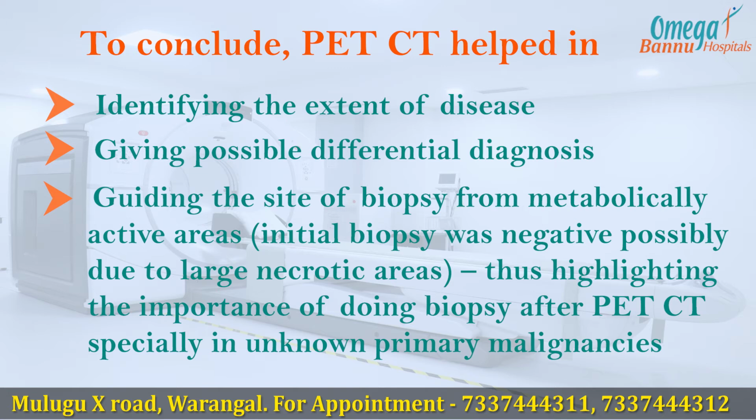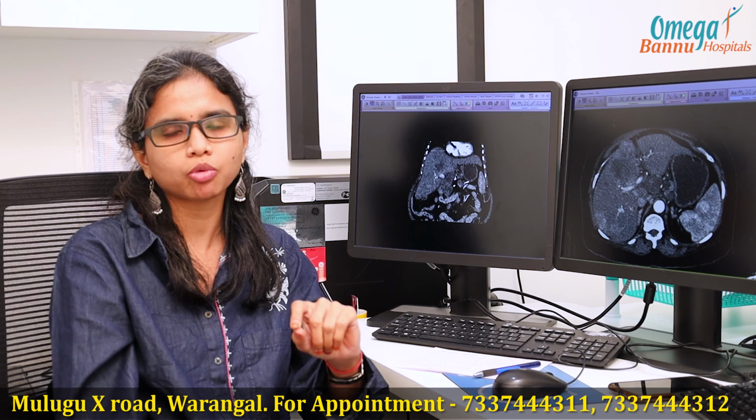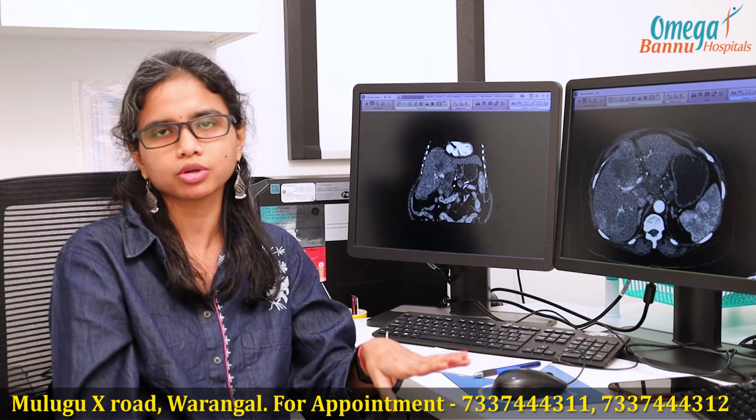Initially, even though the biopsy was attempted twice from the liver lesions, it was negative. Now they have to do the biopsy from the periphery of the lesion, where there are viable cells which are FDG avid. The central necrotic portion is not FDG avid. So hitting the needle in the center portion doesn't yield any positive results.